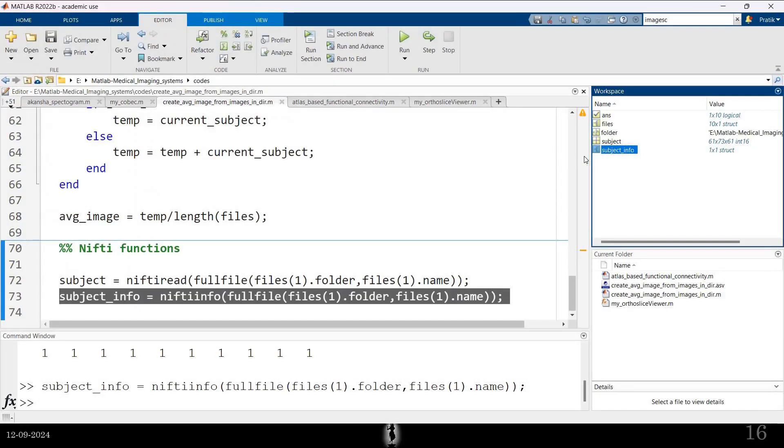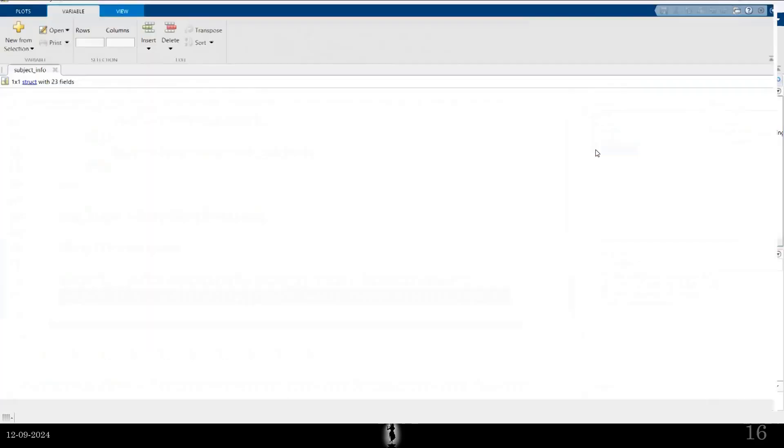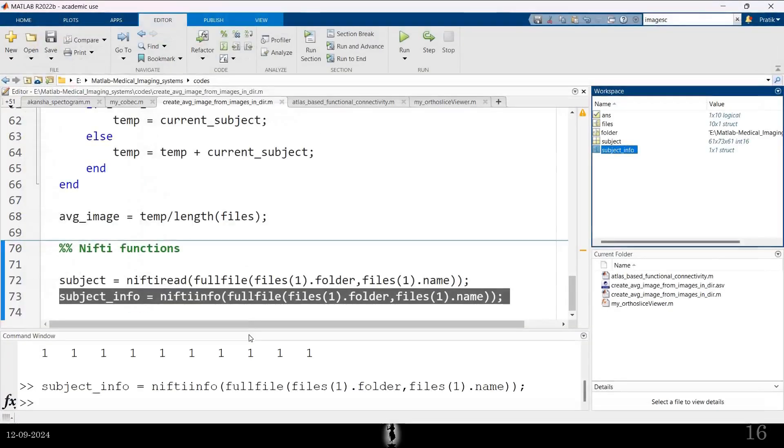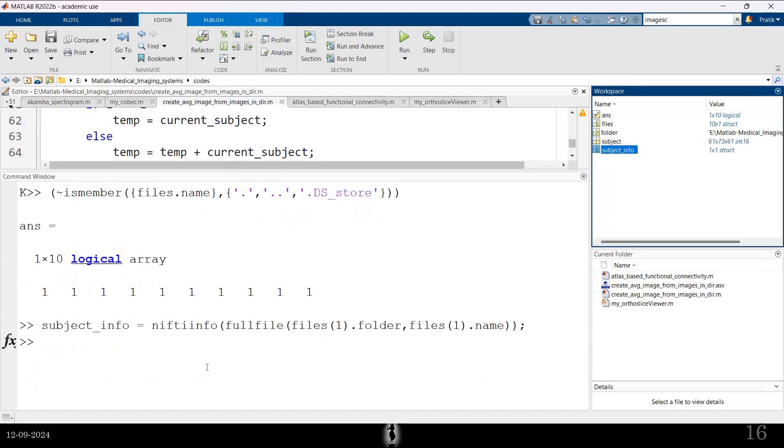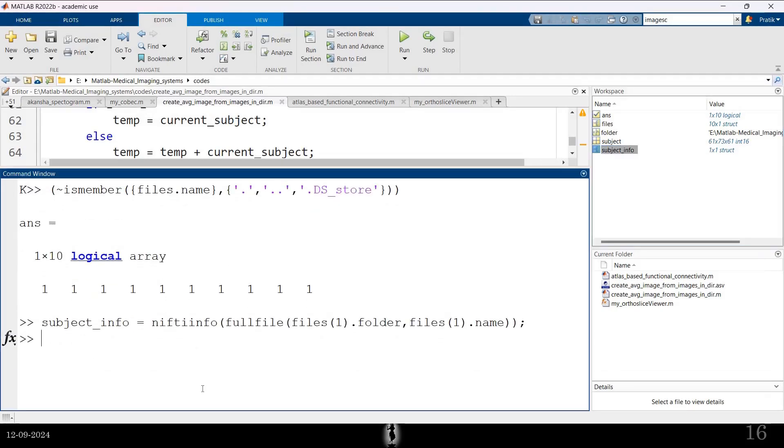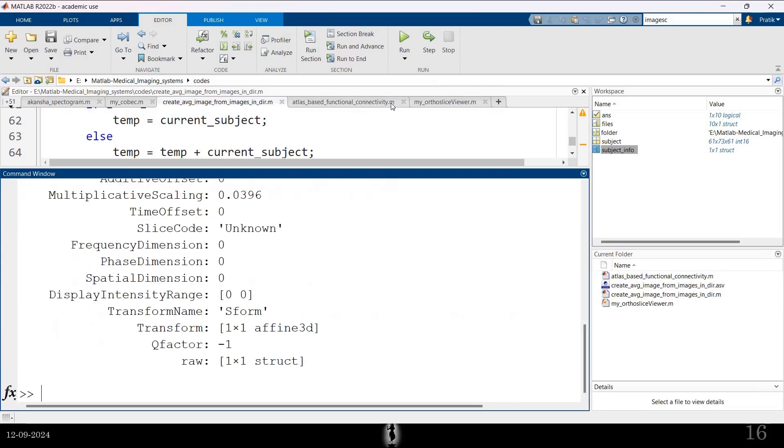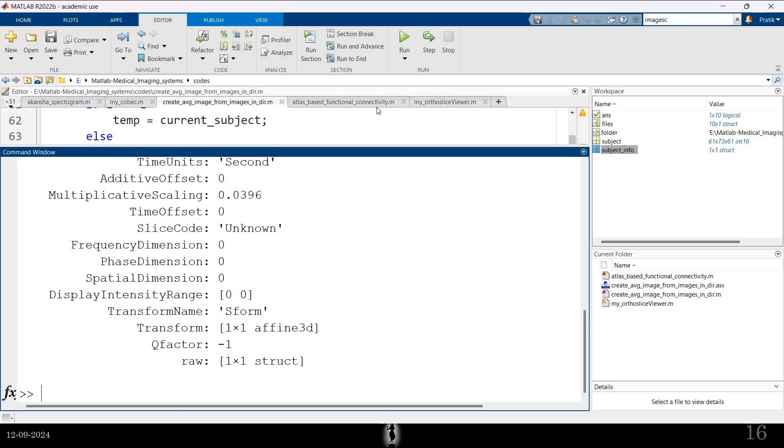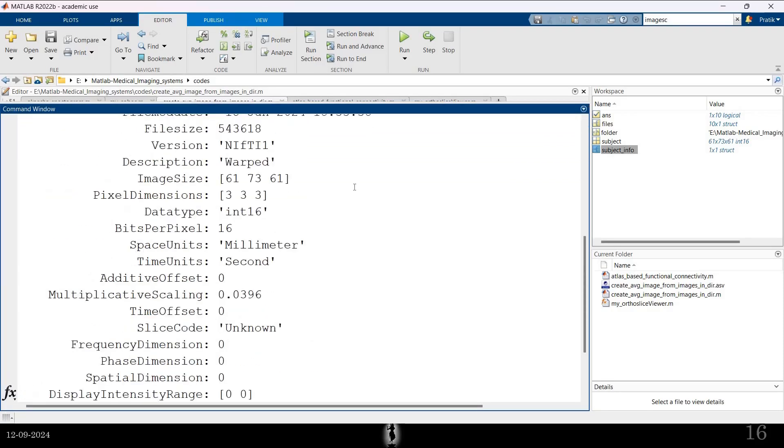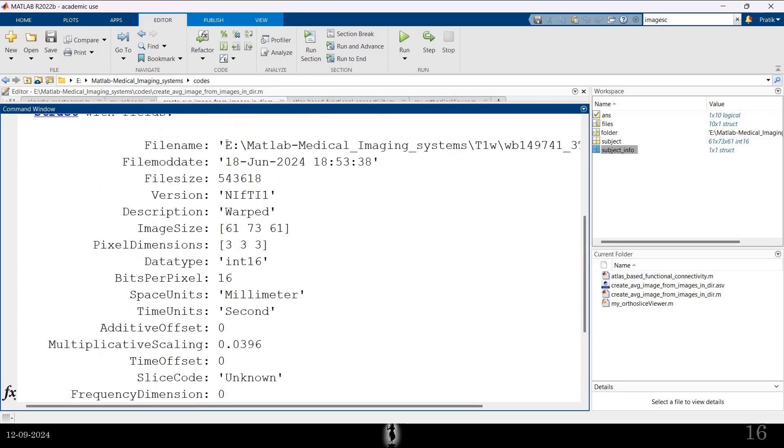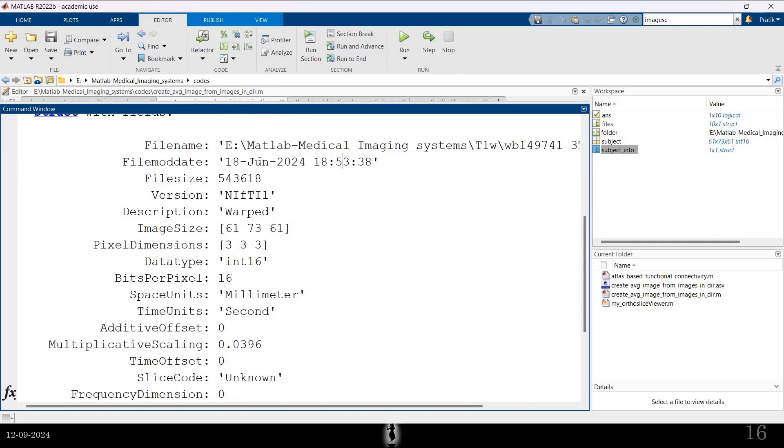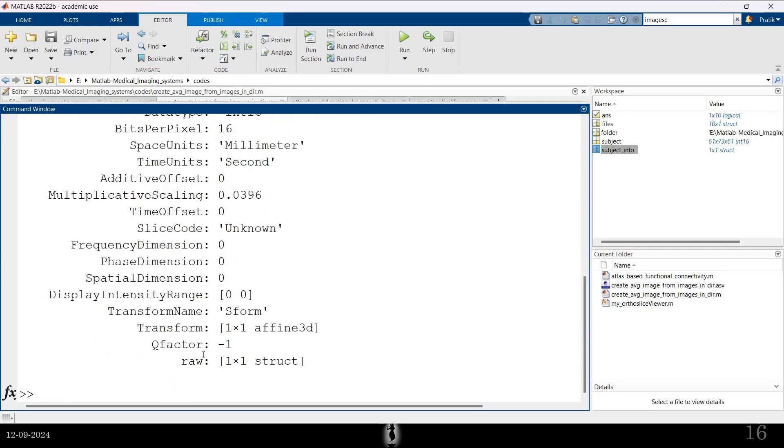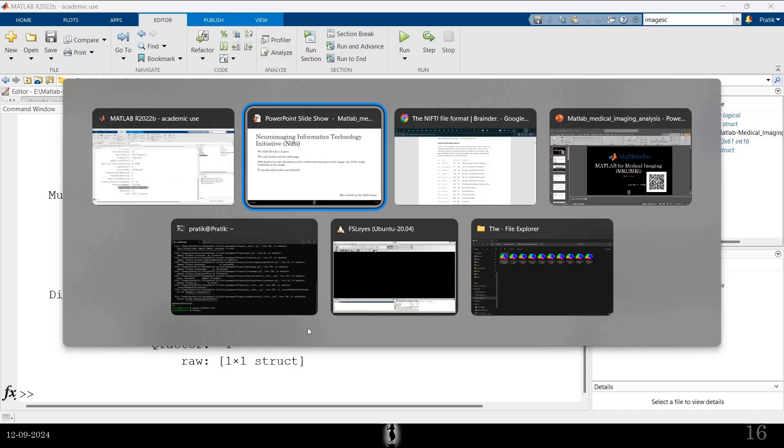It's a structure variable and this is small. Okay. So here we have the Nifty info. It has these things. You can see it has the file name, when it was modified, what is the size, version, etc. These things are okay. But, an important thing is this. Transform. Let me just give you an example for that.